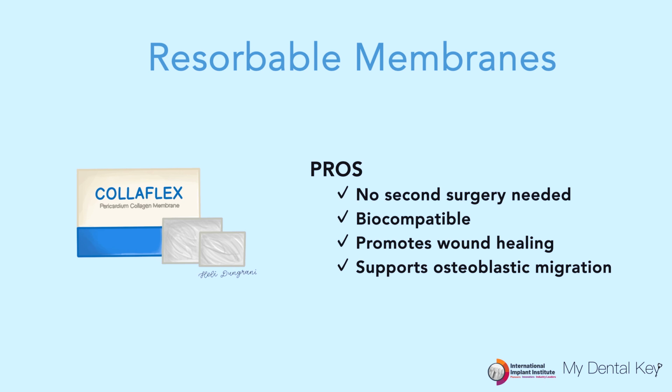However, their rapid biodegradation may limit their effectiveness in procedures requiring space maintenance for longer than 1 month. Collagen membranes are a popular choice among resorbable options due to their biocompatibility, ability to promote wound healing, and support for bone growth by encouraging osteoblastic cell migration. Ultimately, when choosing a membrane, whether it's non-resorbable or resorbable, it's important to pick one that breaks down at a rate that matches bone turnover.